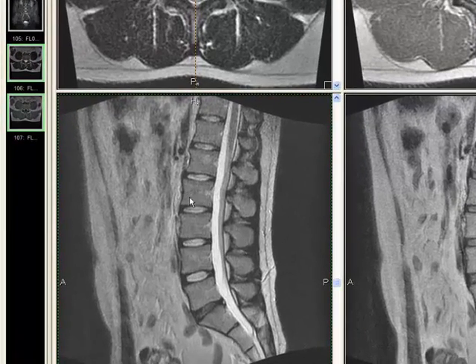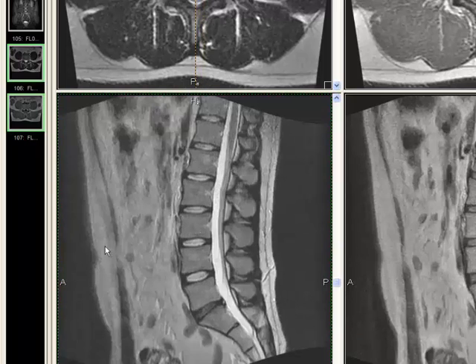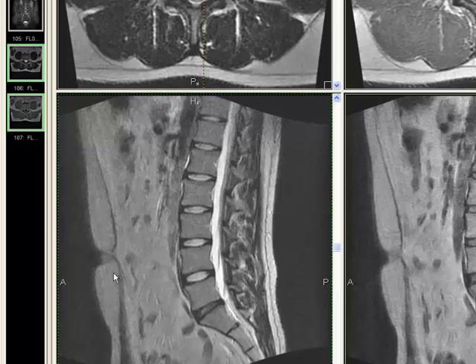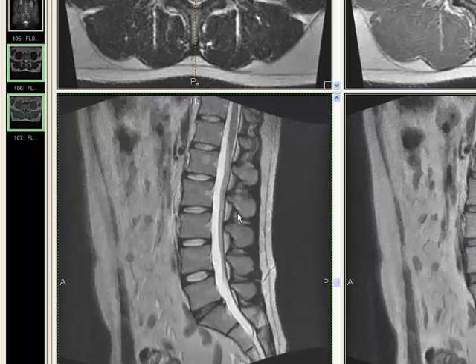Before being able to discover and understand abnormalities of the lumbar spine on MRI, you first have to be able to recognize normal anatomy on these images. So let's dedicate this first video to reviewing normal anatomy.